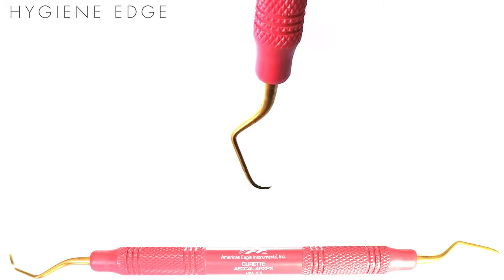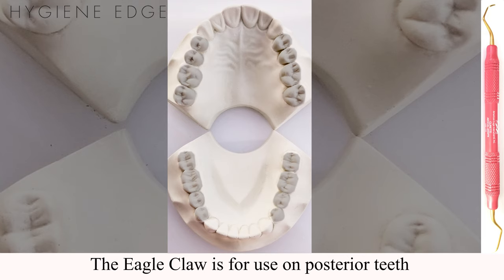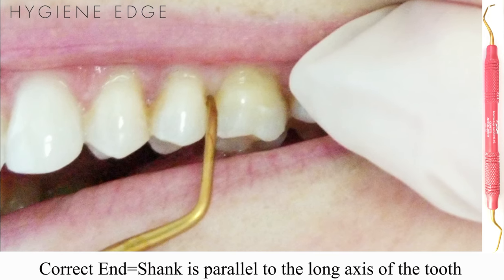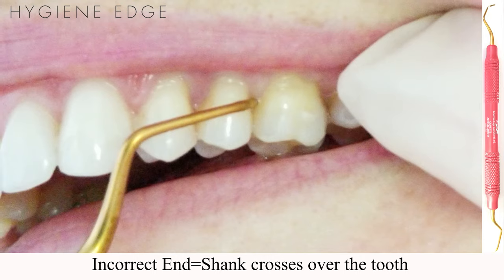The XP Sharpen Free Columbia 4L4R is a universal curette made for scaling posterior teeth. The correct working end is found by making the shank parallel to the long axis of the tooth. If the terminal shank is oriented across the tooth, you have the incorrect end.